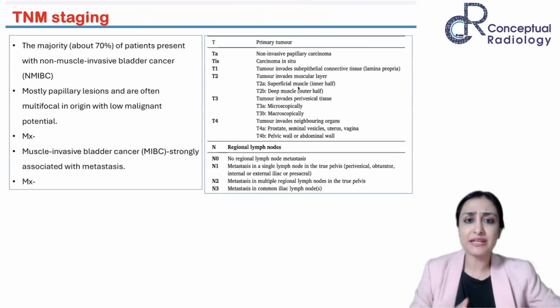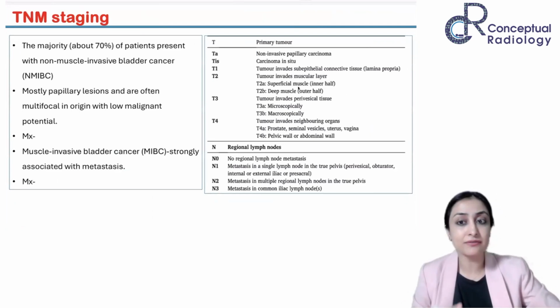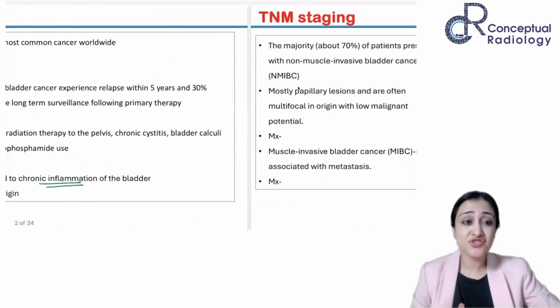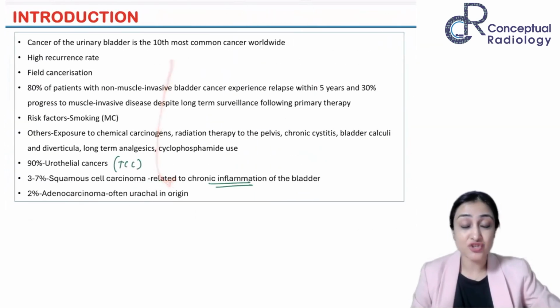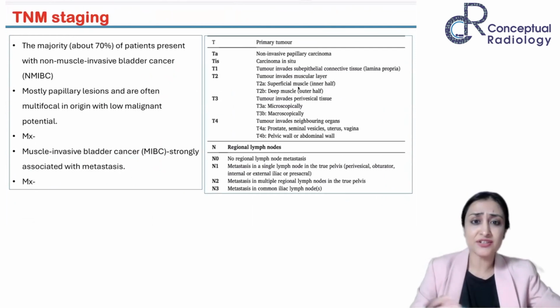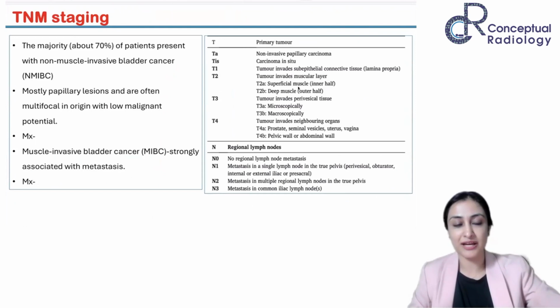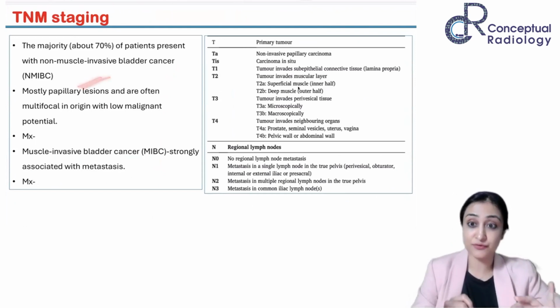And this is very, very conceptual. If you understand the next three slides, you will never have to read bladder VIRADS again, okay? Repeat what part? This is just introduction, right? There's nothing much. I'm just starting now with the most important part, okay? So there's nothing really to be repeated in what I've already covered before, I had a power cut. So I'll just focus now.